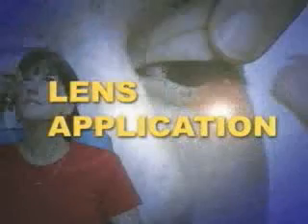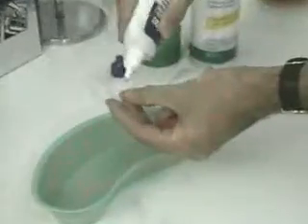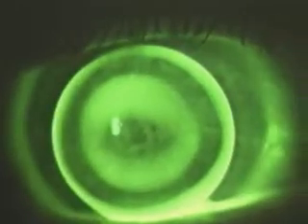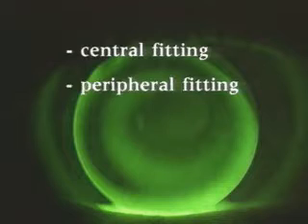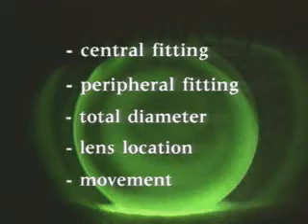Lens application. Trial fitting lenses may be stored dry or wet. Dry lenses need to be lightly cleaned, rinsed and then wetted with a conditioning or wetting agent prior to application. This prevents the problem of non-wetting patches on the front surface of the lens, which may hinder the fitting assessment. Lens assessment. The key fitting characteristics that must be assessed and optimized are the central fitting, peripheral fitting, the total diameter, lens location, and the amount of lens movement.